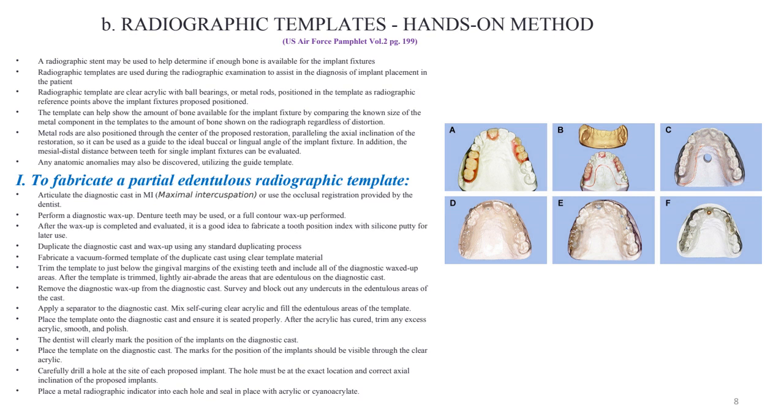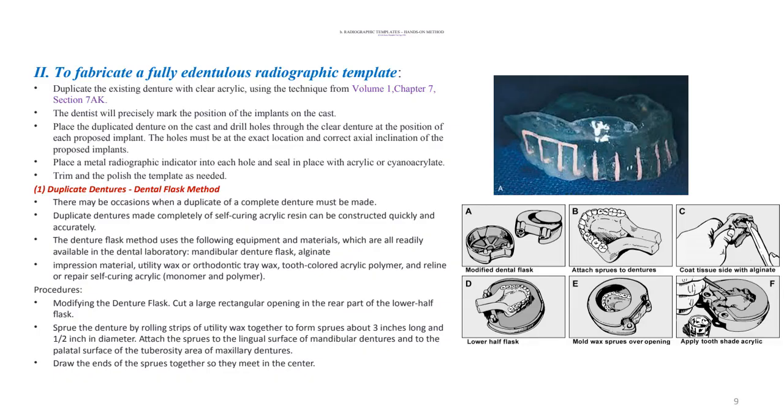Apply a separator on the diagnostic cast, mix the self-curing clear acrylic, and fill the edentulous area on the template. Place the template into the diagnostic cast and ensure that it's seated properly. Once the acrylic is cured, trim the excess acrylic smooth and polish.